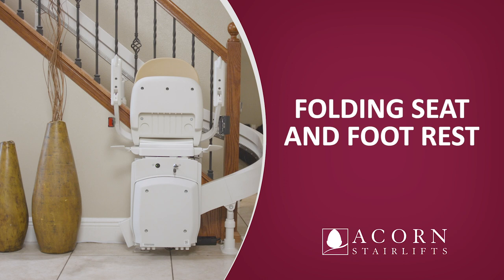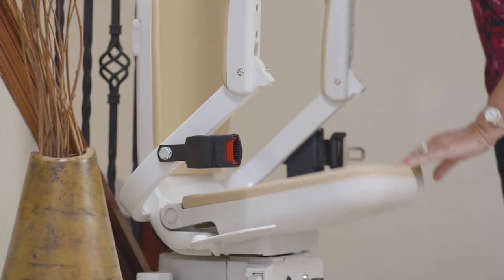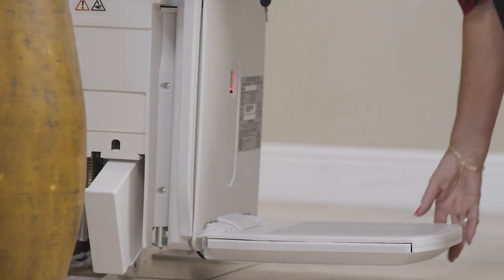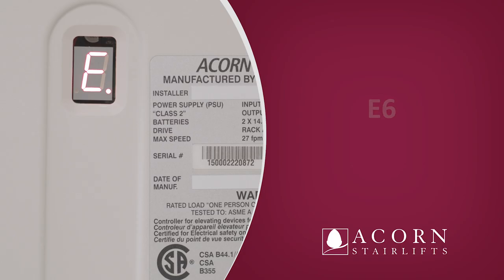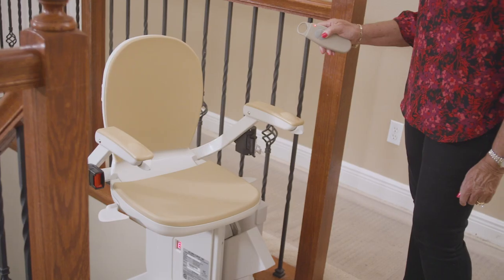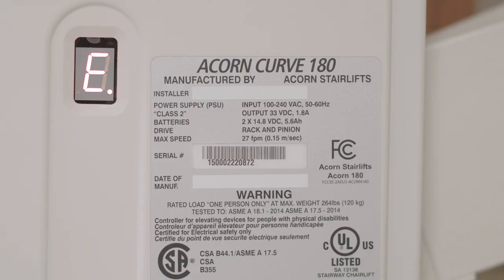Folding seat and footrest. The seat, arms, and footrest can be folded up when not in use to allow greater access on the stairway, efficiently using the space in your hallway. While folded, the stairlift can still be operated using a remote control handset. Unlike the paddle switch, the remote handset will operate the stairlift while in the folded position. However, it will not work if the seat has been turned away from the normal riding position. This will be indicated by an E6 on the display panel.